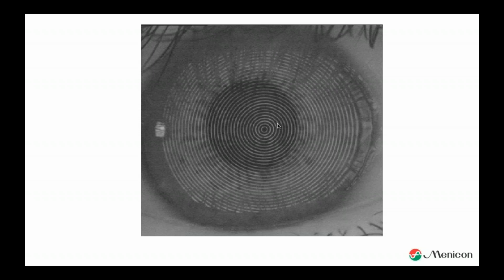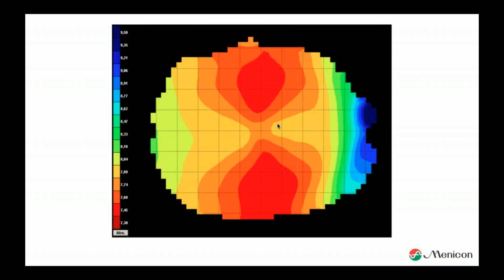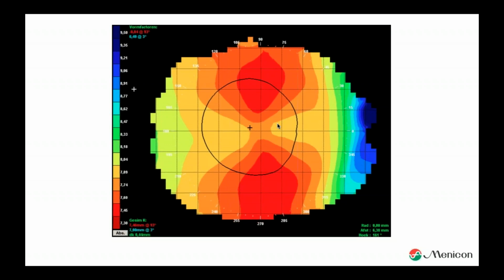is getting the reflection back. But because the eye is not perfectly shaped, all the circles will change a bit. It's not a perfect circle anymore. It's a bit deformed. So the topographer device knows the difference. Okay, this is the perfect circle I project on the eye. This is what I get in return. Well, this is the difference. So this is the shape of the cornea. In this case, we see an astigmatism with the rule.